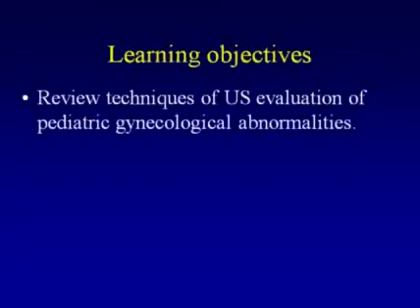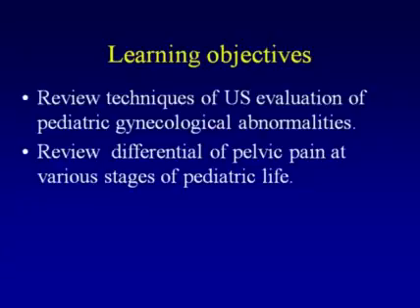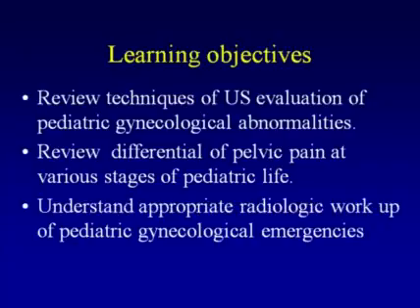Today we'll review techniques of ultrasound evaluation of pediatric gynecological emergencies. We'll review differential of pelvic pain at various stages of pediatric life, and we'll discuss the appropriate radiologic workup of the emergencies of the pediatric GYN exam.